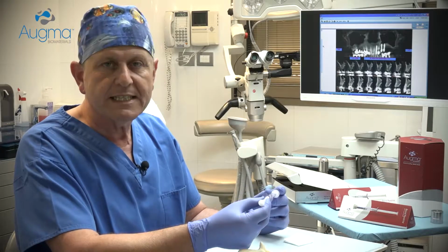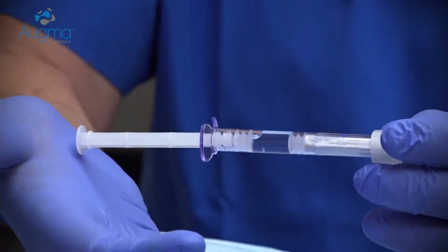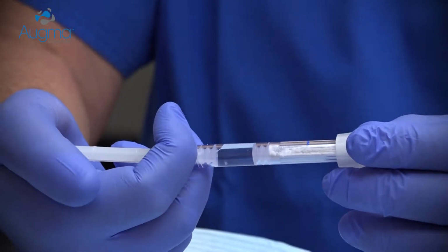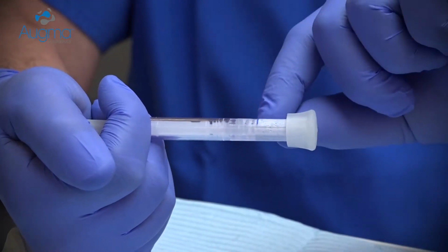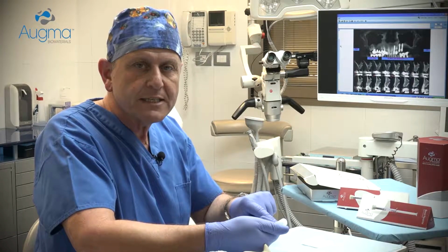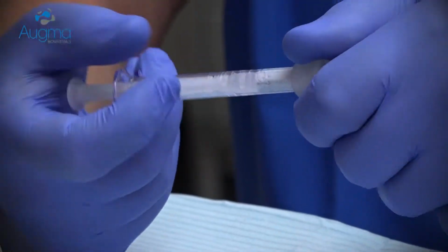Now, in order to activate the material, all you need to do is push the shaft against the palm of your hand and start pushing the piston until the first one reaches the blue line. At this stage, the material has gained the right viscosity and is ready to be placed in the grafted site. Now, remove the syringe head.